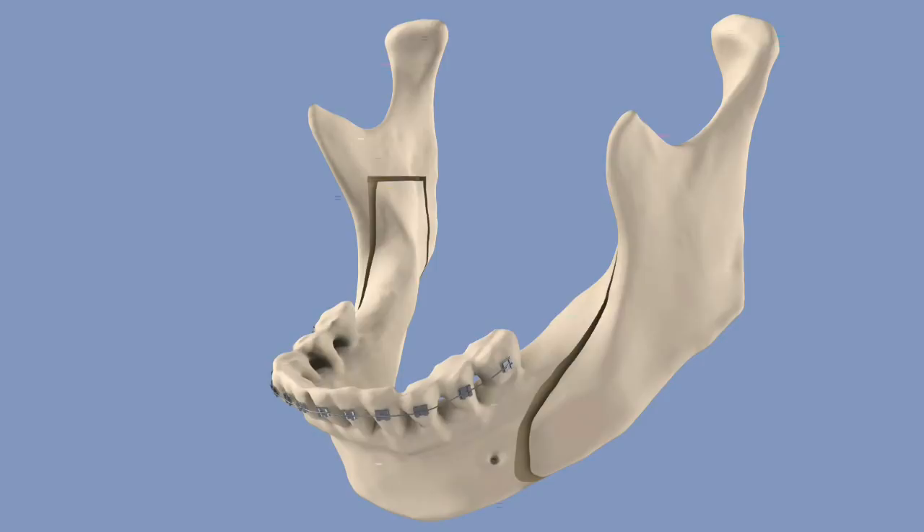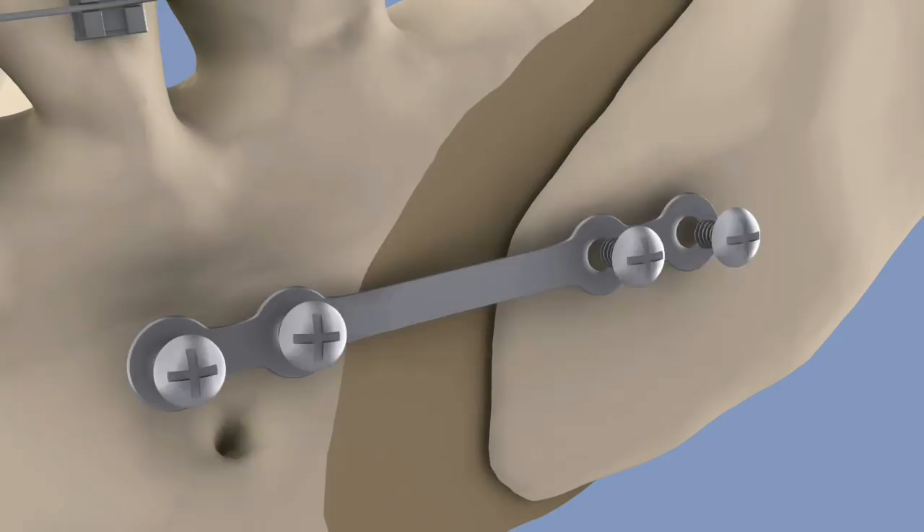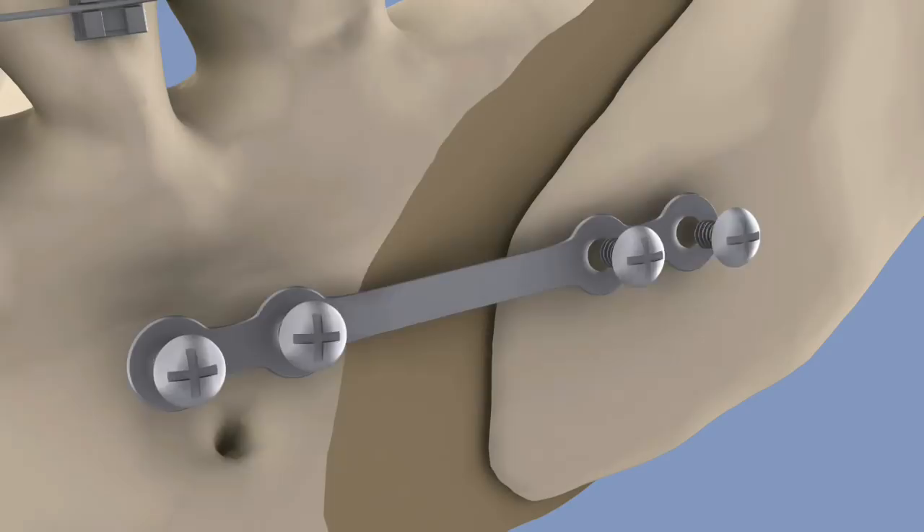Once the bone is fully separated on both sides, it can be moved forward to a more fitting position. Plates and screws are then put in place to allow for natural bone regrowth between the pieces. The corrected jaw will align upper and lower teeth, as planned out in advance with your orthodontist.